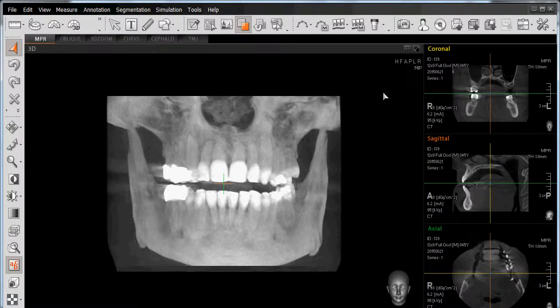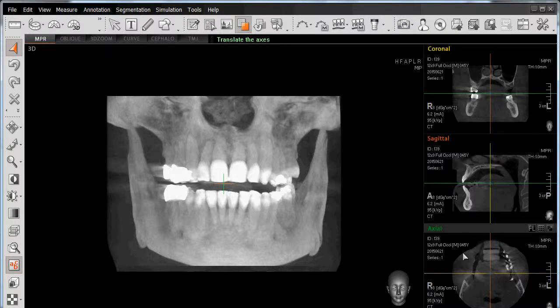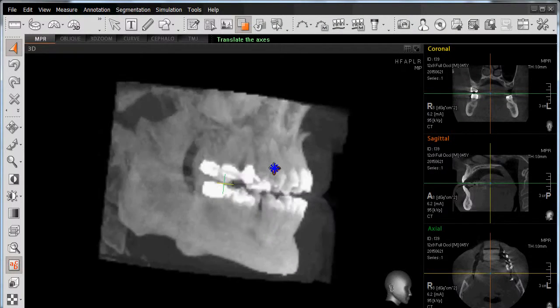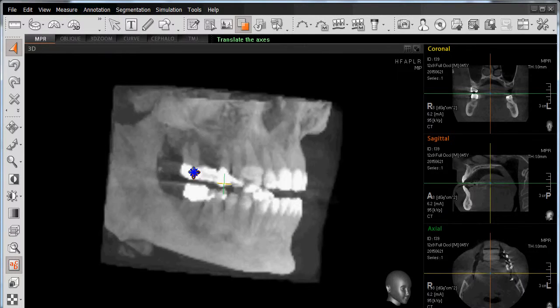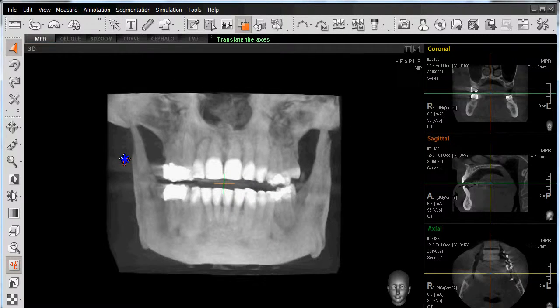This will then change our view into a grayscale view, similar to that of our coronal, sagittal, and axial view. However, we also have the functionality to right-click and manipulate the scan, just as we did for our virtual rendering.